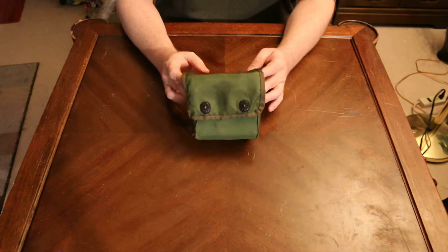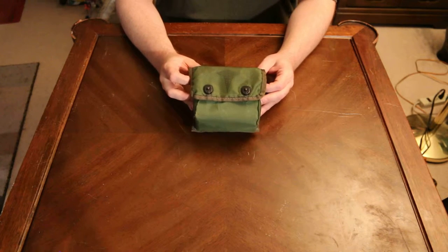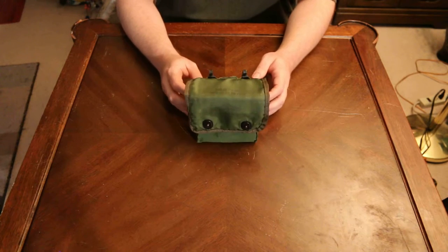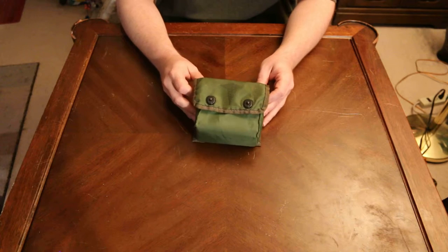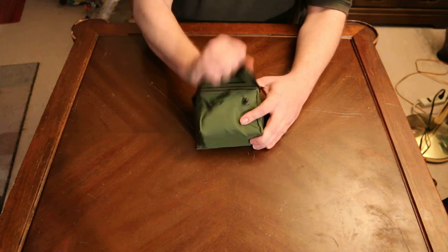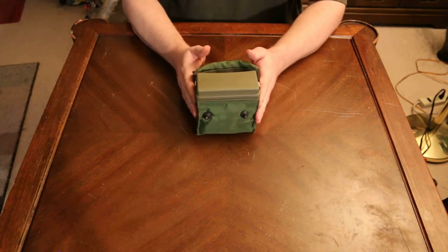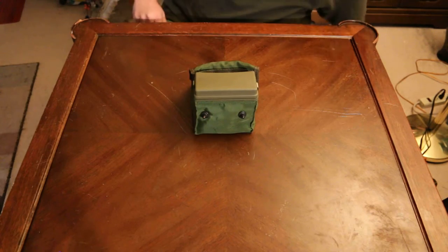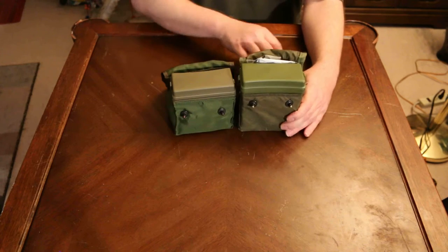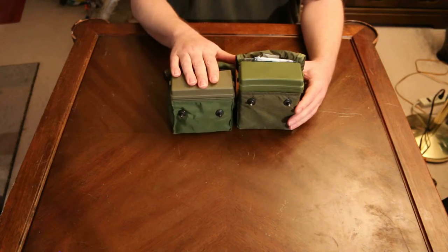Here I have another what looks like military issue 1980s style personal first aid kit. However this is not a military issue. This is actually a civilian version of the military's personal first aid kit. As you can see here you got the pouch, you got the inner box and I will show you here with the military one. As you can see the military one is a little bit higher than this one here.